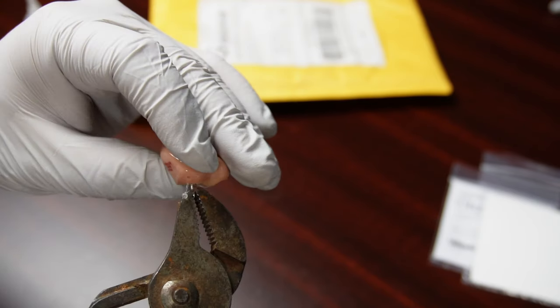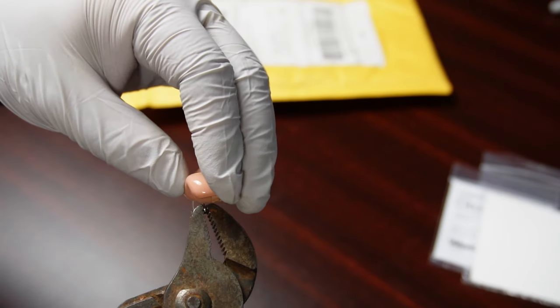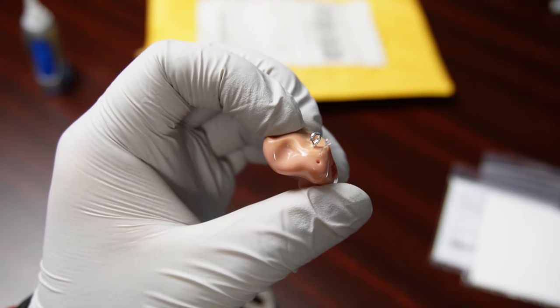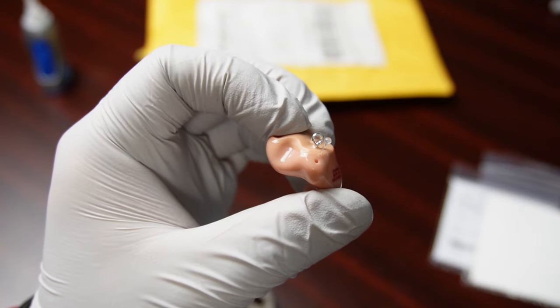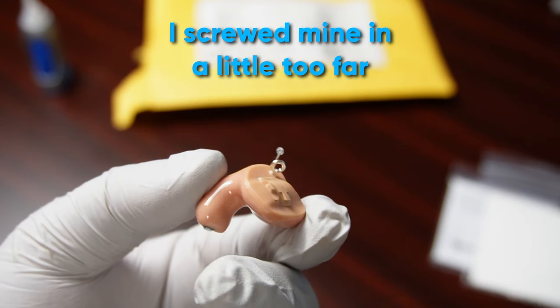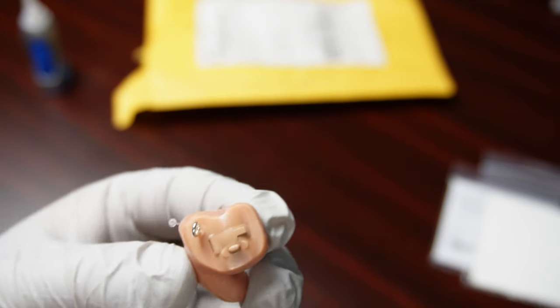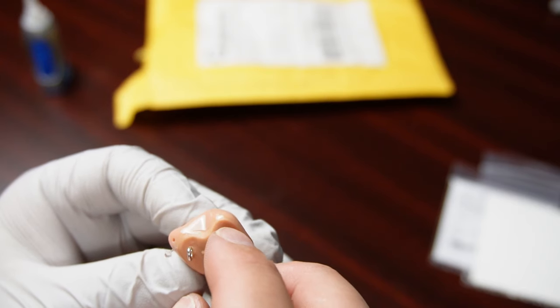If you screw it in too far, the threads will go all the way through the faceplate, and the only thing that will really be holding it in will be the unthreaded shaft, because you screwed it in too far. So leave a little bit of thread sticking out, make sure it's not too far in. And that's it. Let it sit for 5 or 10 minutes. Let the glue really settle, and you should be good to go.